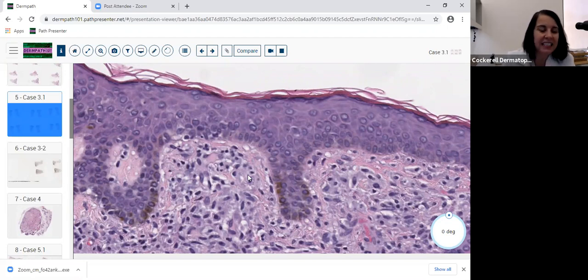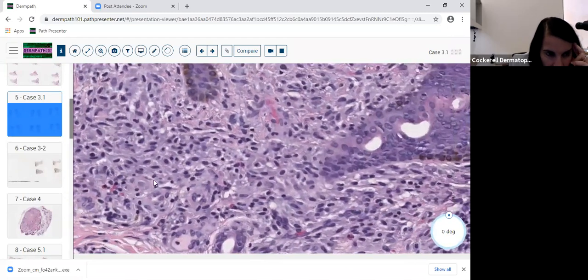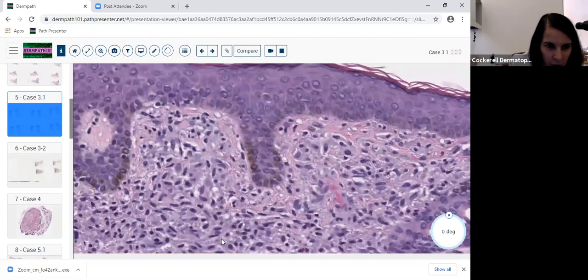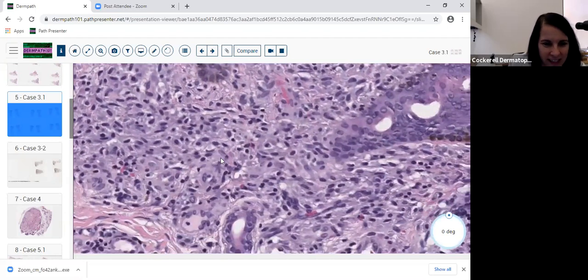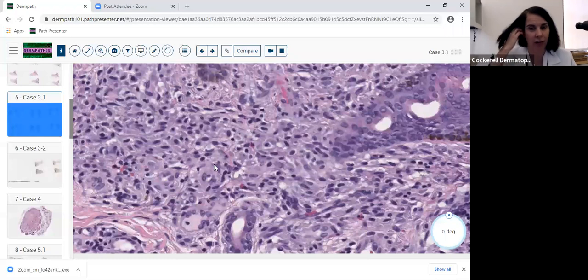Eosinophilic granuloma, if you want to, you can use the CD1a stain. You see scattered eos here, and if you didn't believe these were mast cells and your tryptase wasn't positive, you definitely wanted to rule out eosinophilic granuloma. These aren't reniform, so it's really out. There's no epidermotropism, so I just wouldn't think of that entity, but you could do a CD1a and S100 to rule out something like an eosinophilic granuloma, Langerhans cell histiocytosis, etc.